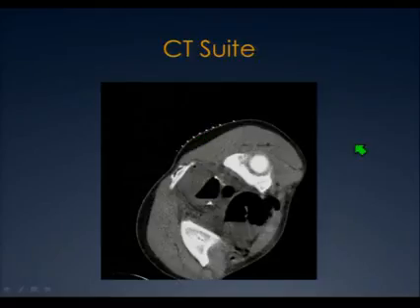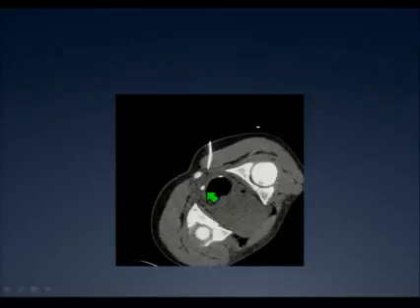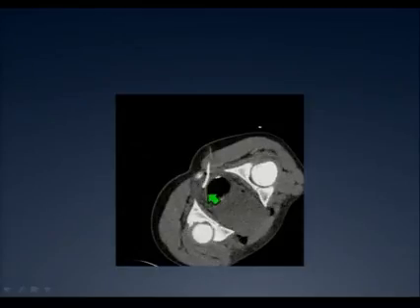We're going to come in from an oblique angle. This is the needle going into the abscess. I get pus back, and I put a drain in. This is the tip of the drain. This is the drain coming in. There it is. It's in there.